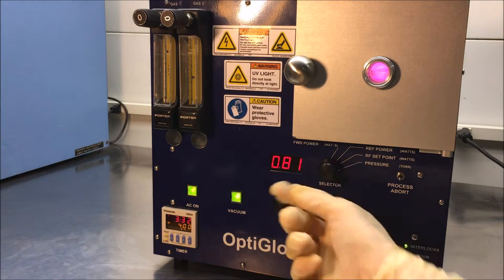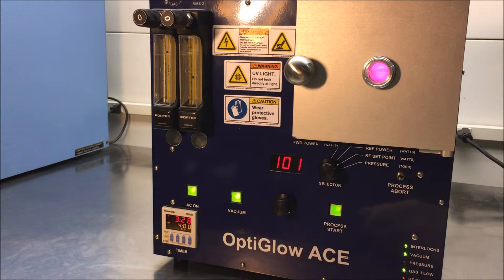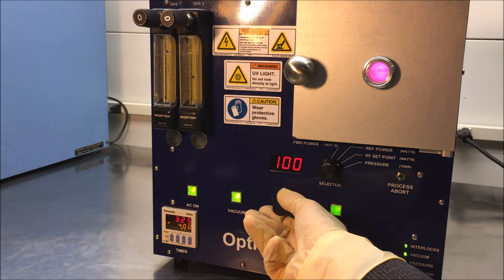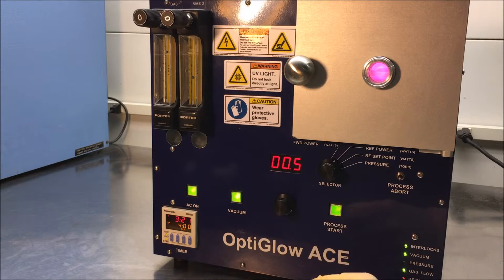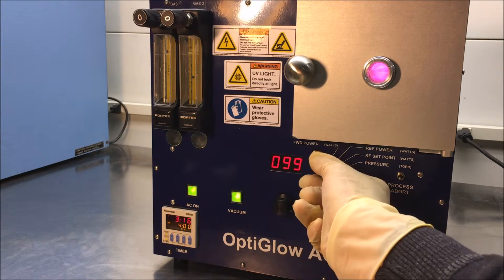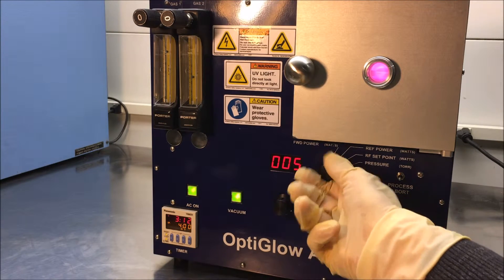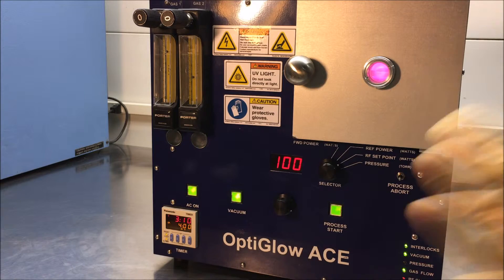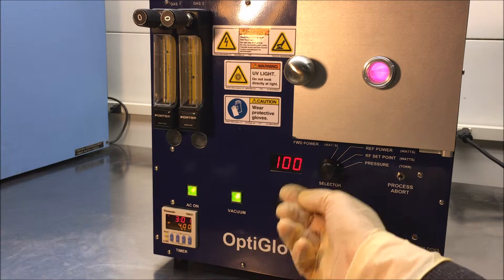Over here on the selector switch, this is for pressure. There's the RF set point. We've set the RF power at, in this case, 100 watts. The reflective power is 0.5 watts, which is extremely good. The actual power going into the system is right at 100 watts or 99 watts. So we give you a reading of not only what you set it at, but also the amount of power going into the system.